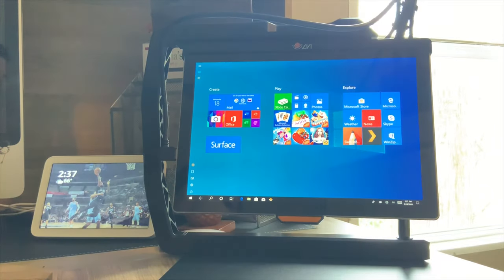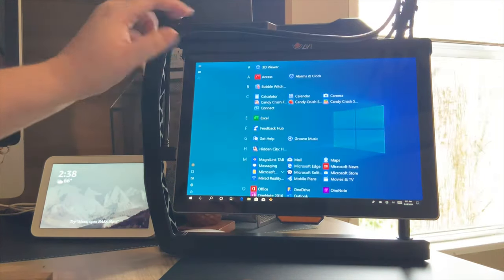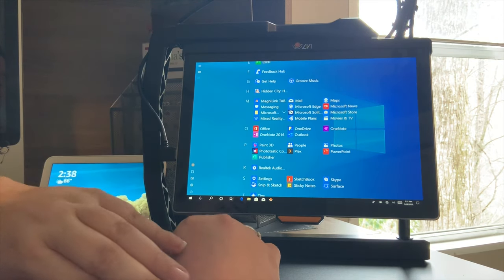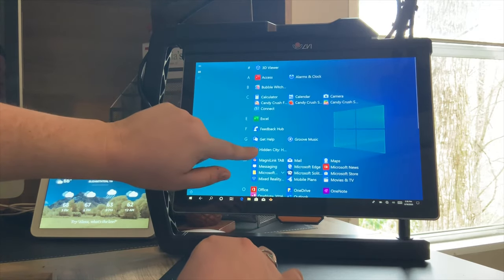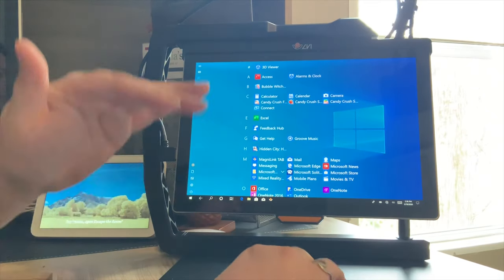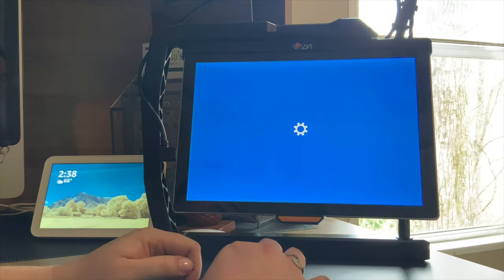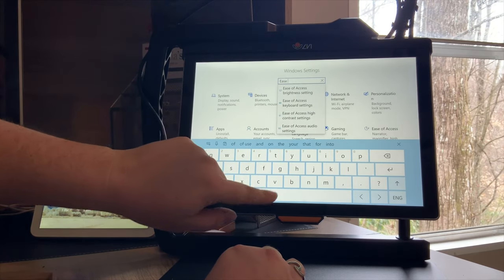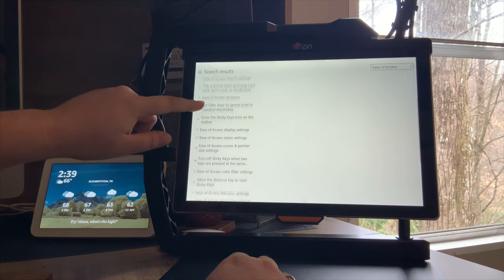The interface looks like a Windows 10 computer. I can go into all the apps, which shows everything available. I do have Microsoft Office — Word, PowerPoint, OneNote, Excel — all the things a student might use are already on this device. The Surface tablet is all one piece; you don't have to buy the stand and tablet separately, as I understand it. If I wanted to, I can go to Settings and find what they call Ease of Access.